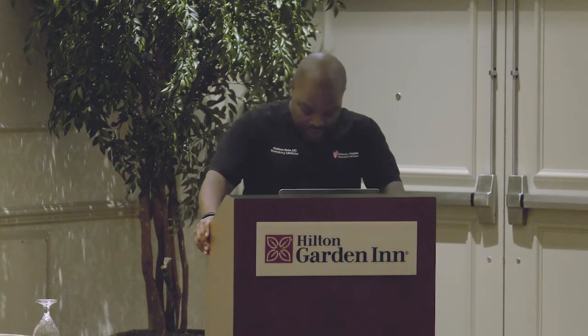So the most helpful use I see with the ultrasound for you guys is gonna be when it comes to abscesses. None of us wanna drain an abscess at 10:30 at night before you have to go home at 11. So one of the things I always do is I show the patients, look, there's nothing in there to drain, so I can't drain it, go home. So if nothing else, you'll be able to use the machine to help augment some of your workflow in the department.